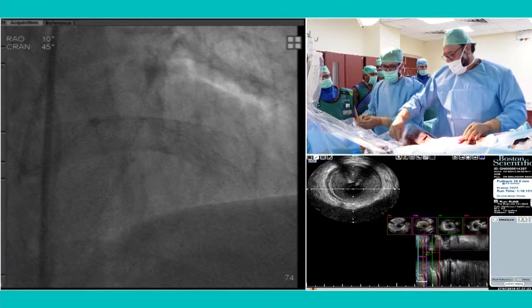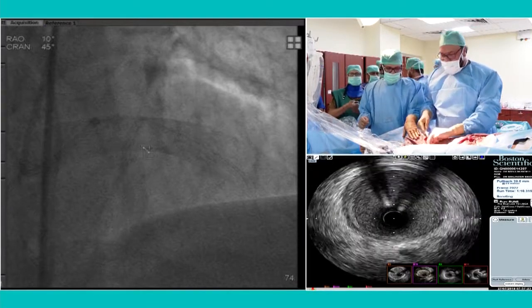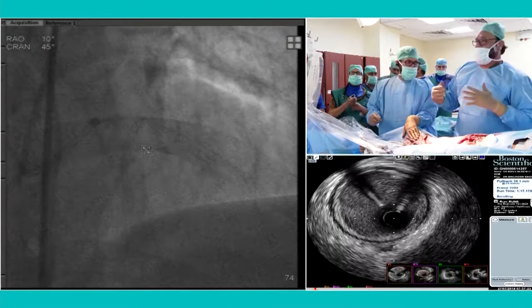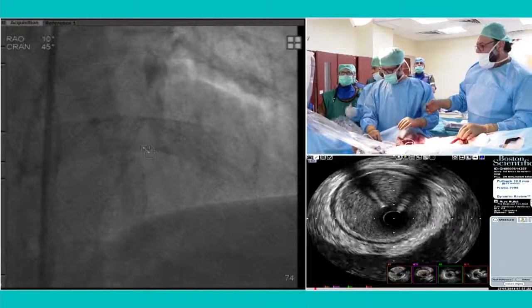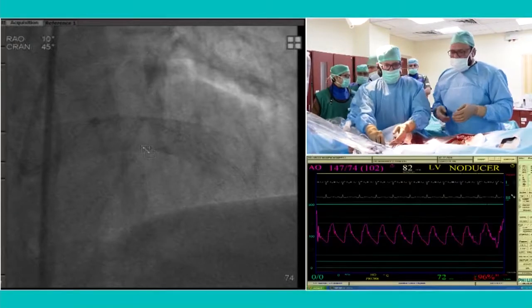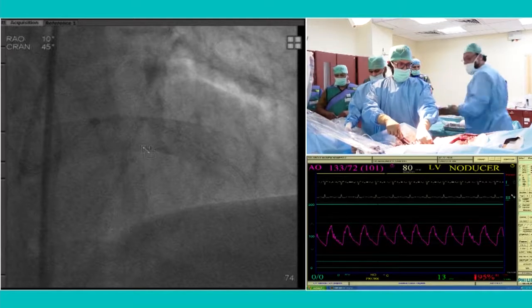I know people say that it's easier to wire, it's a marker, but I agree sometimes in a diagonal or an OM, you can keep the wire if it's very tight. But usually in a circumflex, I don't keep the wire. But it may also help.